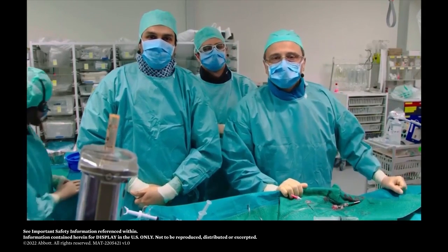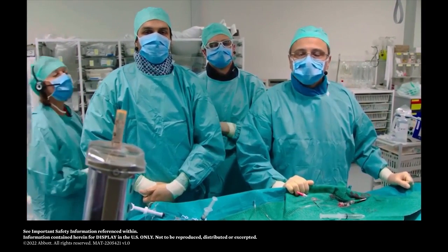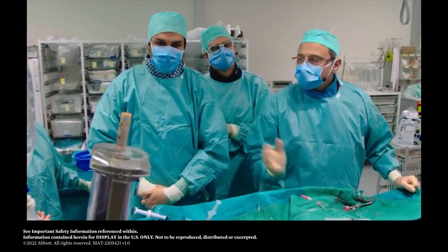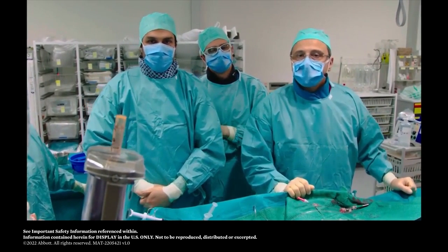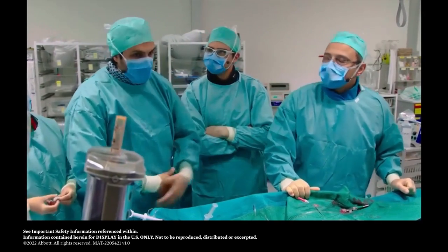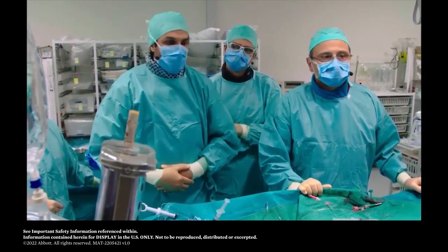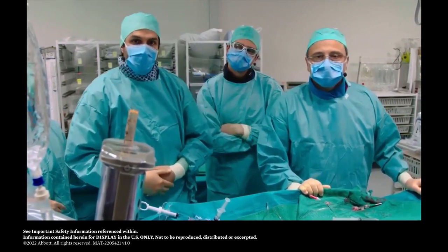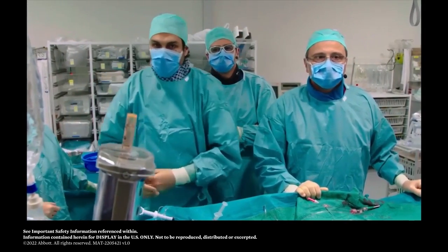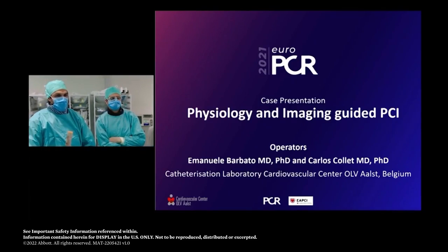Thank you very much, Joel, and welcome to the Cardiovascular Center Aalst. My name is Emanuele Barbato, one of the interventional cardiologists here. Without further ado, let me hand over the word to my colleague and friend, Carlos Collet, who will introduce the team and then the next steps of the procedure. Carlos. Thank you, Emanuele. Yeah, so we're here, the complete team. We have Professor Barbato, who's going to be the first operator for this case. I'm going to help him with the physiology and imaging. We have our interventional fellow, Giuseppe Esposito, and of course, the whole team behind us, and others on the table helping us.